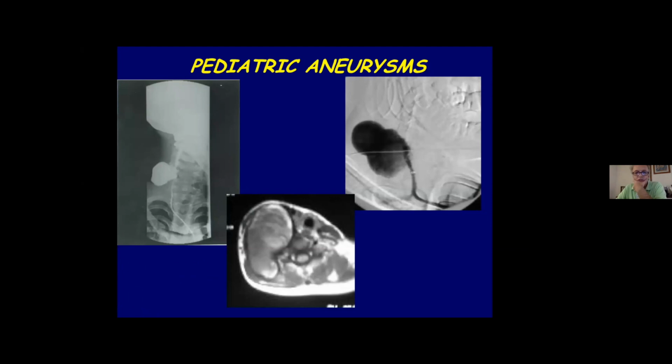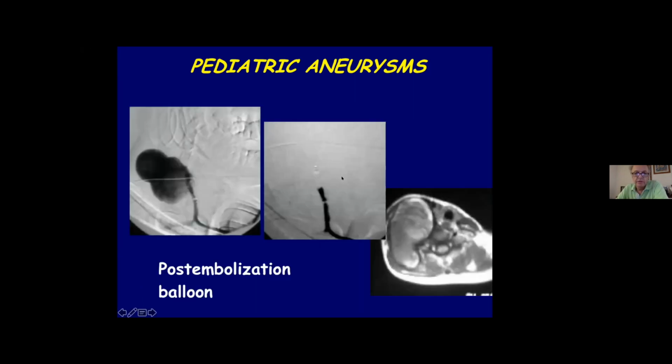I treated in this period with a balloon, I put the balloon here, a detachable balloon. You see the balloon before, after, and thrombus in the aneurysm, totally occluded.